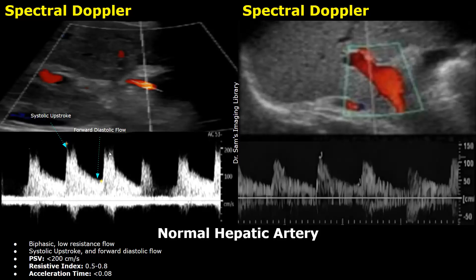A biphasic flow is usually a low-resistance blood flow. The top point of the systolic peak is the peak systolic velocity (PSV). In normal cases, it is less than 200 centimeters per second. In this case, it is almost 200 centimeters per second but does not exceed it. The next parameter is resistive index, which is normally between 0.5 and 0.8, and the acceleration time is less than 0.08 seconds. In the second image, the PSV is just over 100 centimeters per second, so it is a normal blood flow.